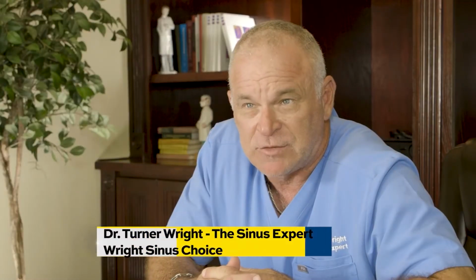We've been doing nasal sinuplasty balloon surgeries for, good God, 7-8 years. You use a small balloon guided by a computer that opens the openings to each one of the sinuses, so those openings don't shut and cause pressure, pain. When people talk about, oh, I have sinus pain, what they're saying is, the opening from this sinus into my nasal cavity over the years has gotten smaller till it occluded, now building up pressure. So the balloon just goes in and reopens the opening.